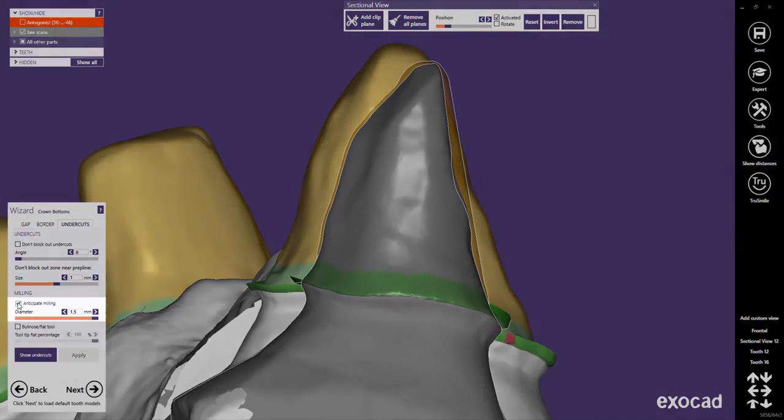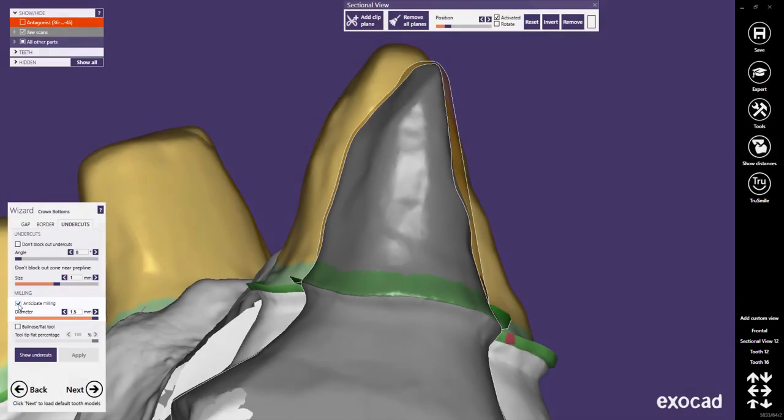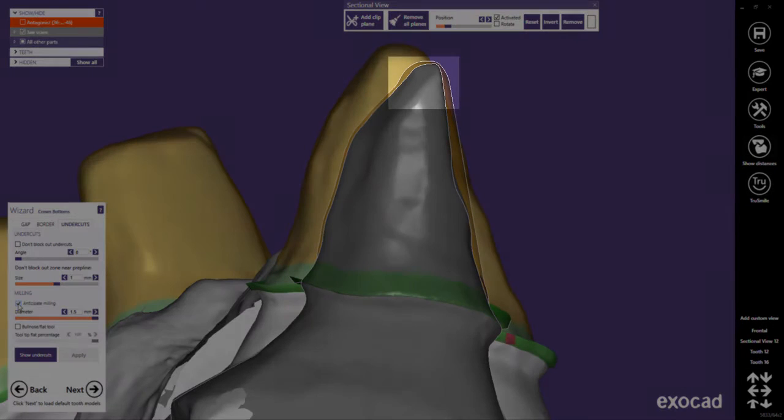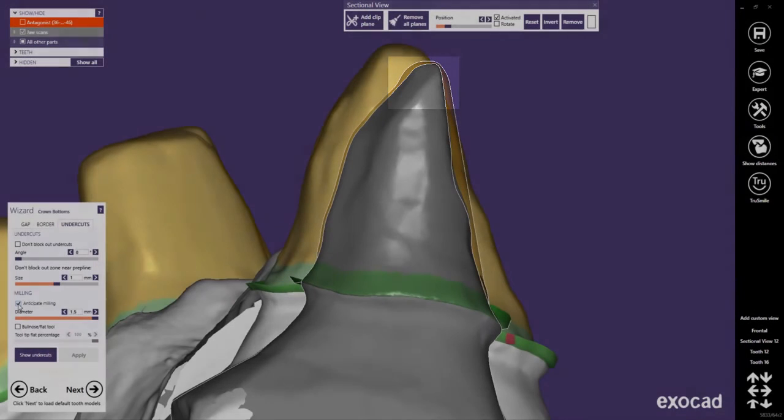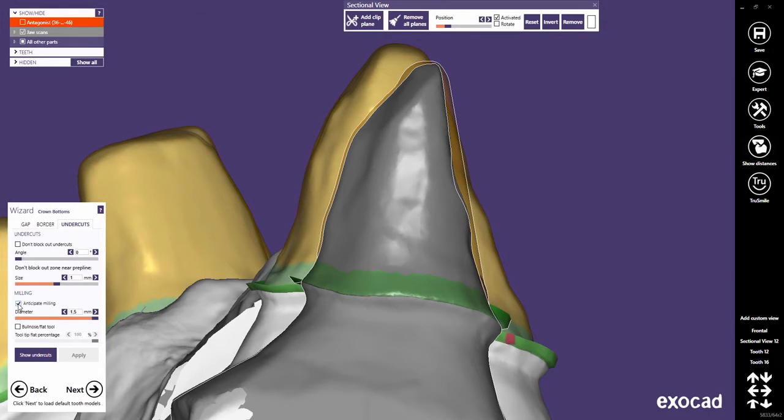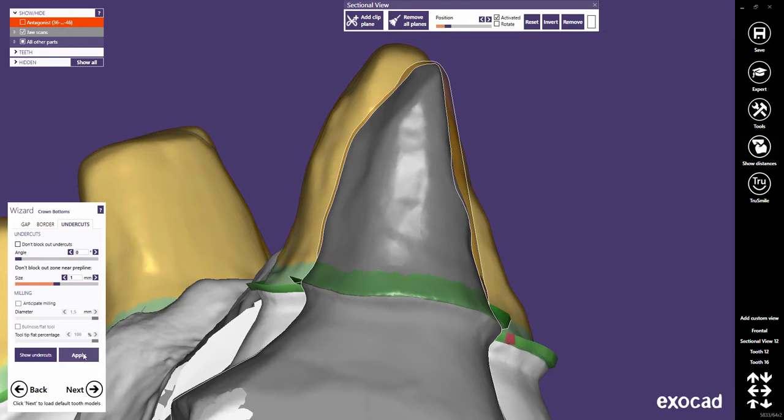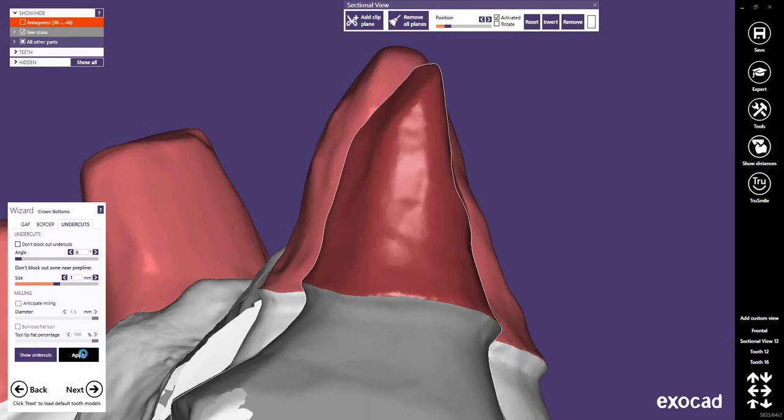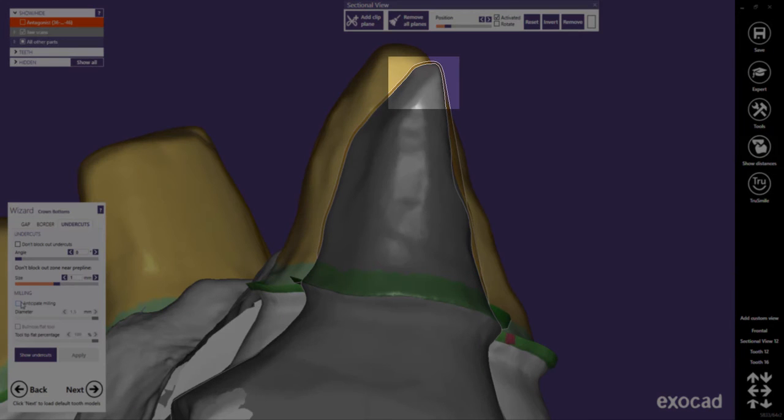We will now have a look at the Anticipate Milling feature. This feature will add a tool diameter compensation to the cement gap for sharp edges. If you have selected a material for milling, it is checked per default. If unchecked, no tool compensation will be computed and sharp edges are just blocked out with the cement gap.